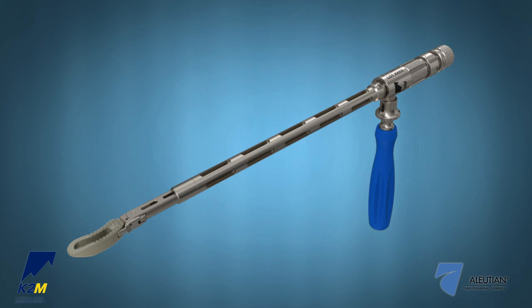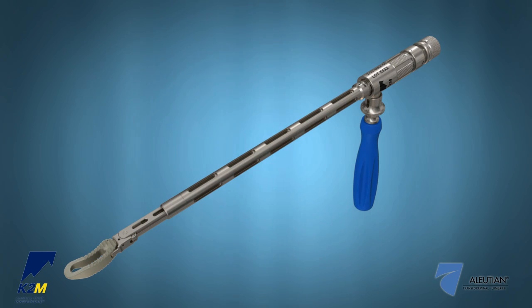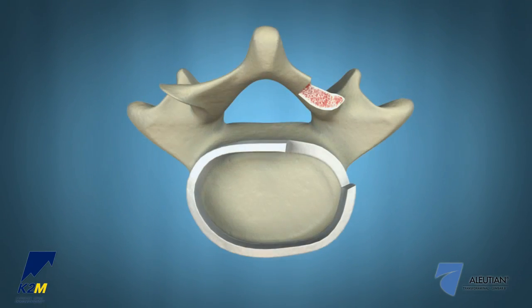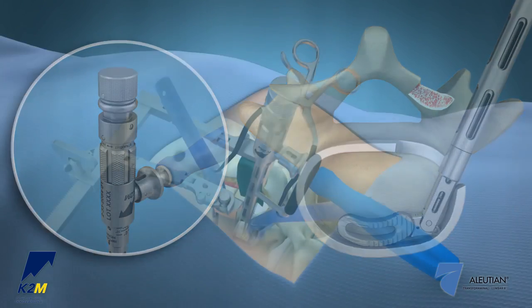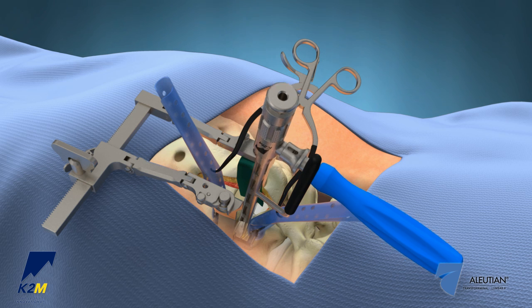A torque limiter in the knob will slip when the implant is securely tightened. The inserter articulates from 0 degrees to 60 degrees by rotating the articulating joint thumb wheel at the proximal end clockwise to aid in maneuvering the implant to the anterior portion of the disc space. Insert the implant into the disc space. Once proper placement is confirmed, disengage the implant by turning the inner shaft knob on the proximal end of the inserter counterclockwise. Completely remove the inner shaft once insertion is complete for cleaning.